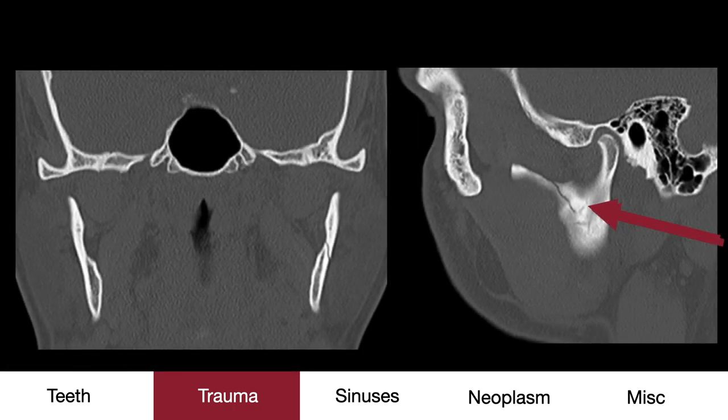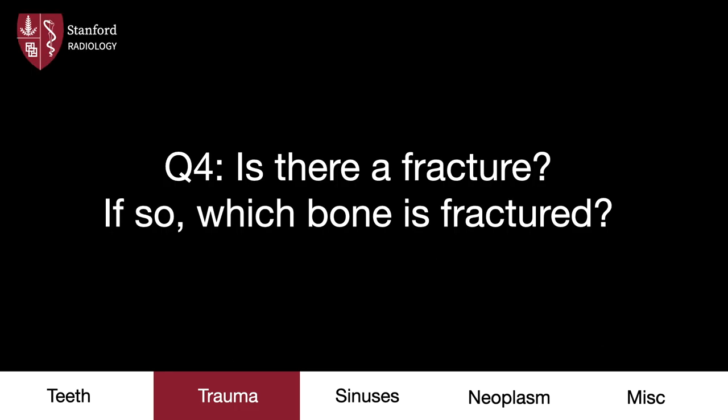A follow-up CT confirms our initial suspicions. Note that the left TMJ is located, which is a pertinent negative. Here's our next case — case four. Is there a fracture, and if so, which bone is fractured?